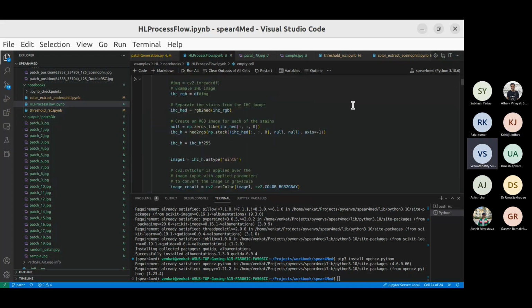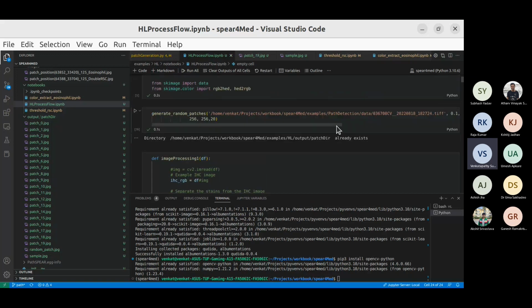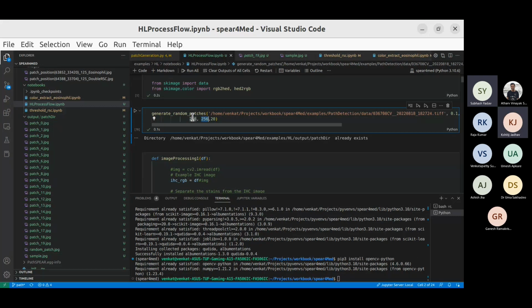Our goal is to look at different zooming levels and different sizes as well. Because I think we'll have to go to 1024, to check at all different levels. And once the patches are ready with all these labeling functions, then Uma and I can have a look at it. But it looks quite impressive, Venkat. Yes, it looks good.